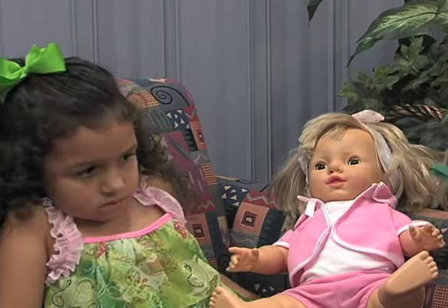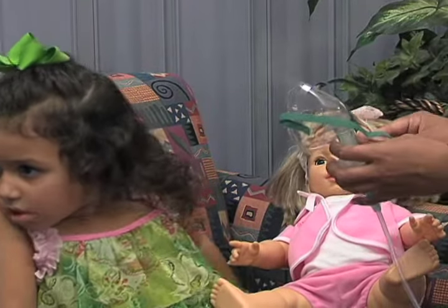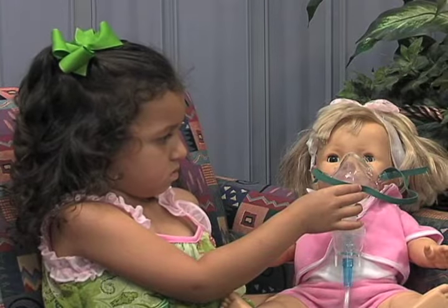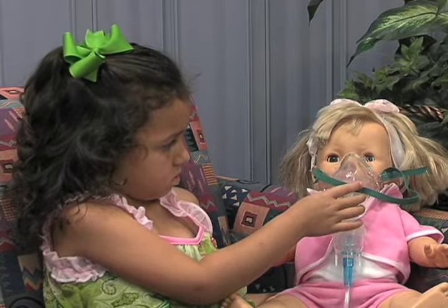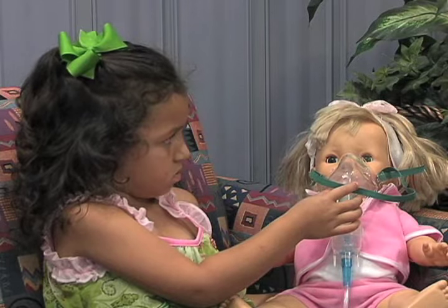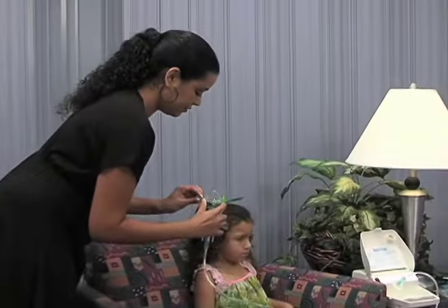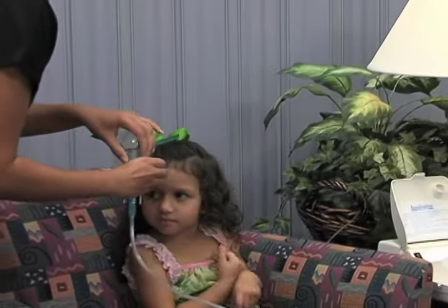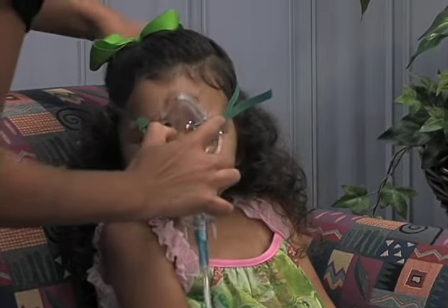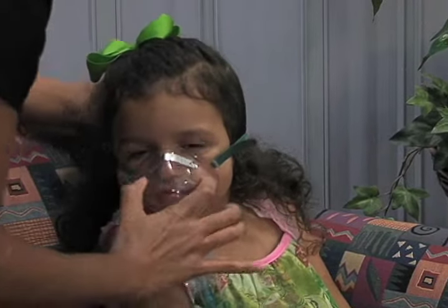Young children can be afraid of the mask, so you need to show it to them before the treatment. You can pretend it's a pilot's mask, you can use it with a doll, or you can let your child play with it for a while. This is a good way to help them overcome this fear. Try to keep your child calm. Some children may start crying at the beginning of the treatment, usually because they are afraid. However, when they realize it doesn't hurt, most children will usually stop crying.